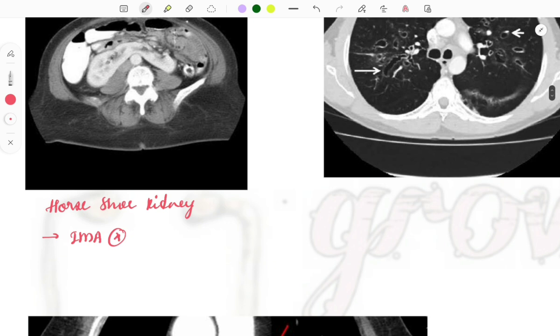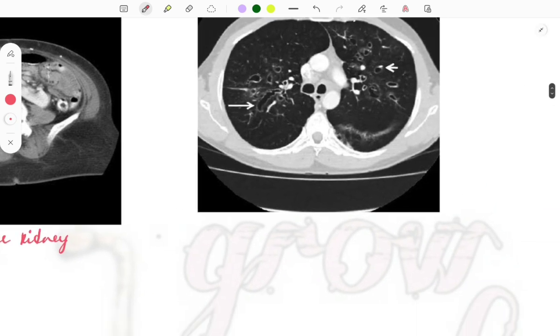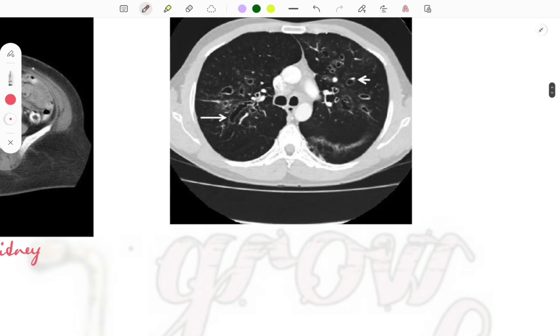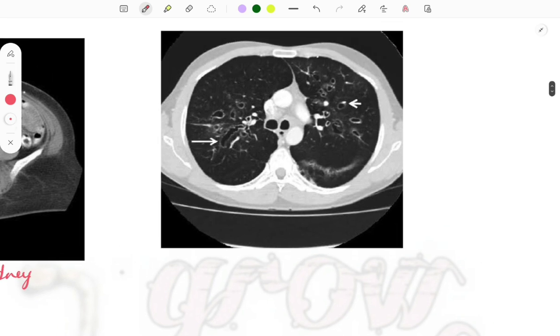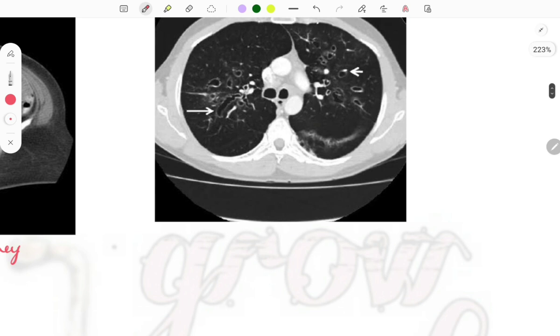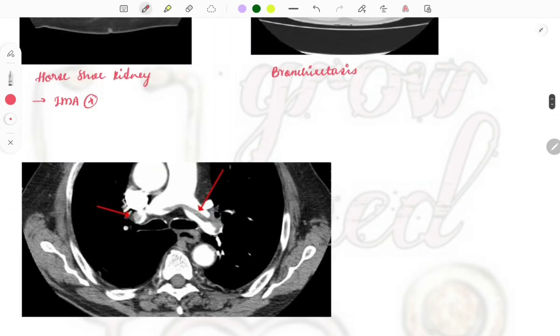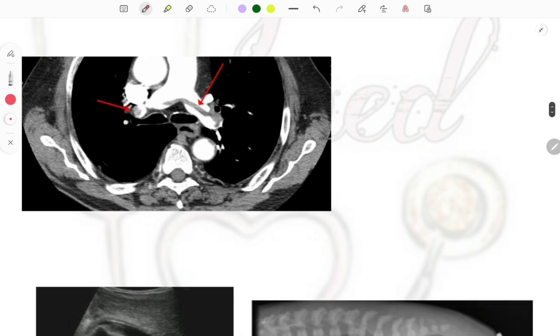This image is of bronchiectasis on CT chest — you can appreciate dilated bronchioles showing the signet ring appearance, where the dilated bronchiole surrounds the blood vessel. This is a famous image for the famous disease bronchiectasis.